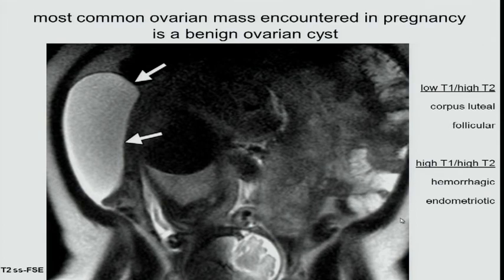It can be a hemorrhagic cyst, which is a cyst that just grew and grew until it distended a capsular vessel and that bled. Or it can be endometriotic. Those will have different signals, and your professors will help you understand the pattern of evolving hemorrhage. It changes on the T2 and T1 signals, and that's another thing you'll have to learn as a first year, how it doesn't always look the same. It depends on the age of the blood products, what they're going to look like on MRI.